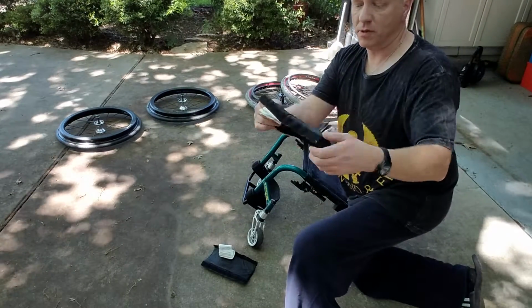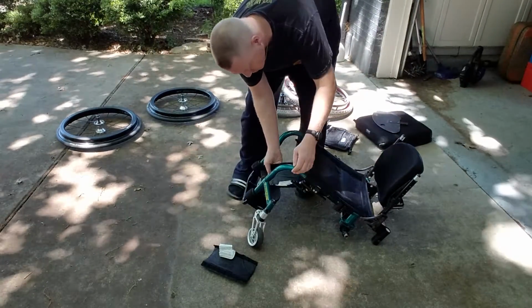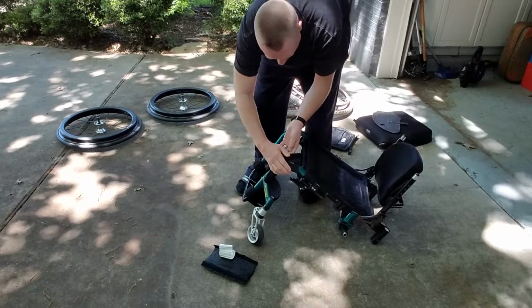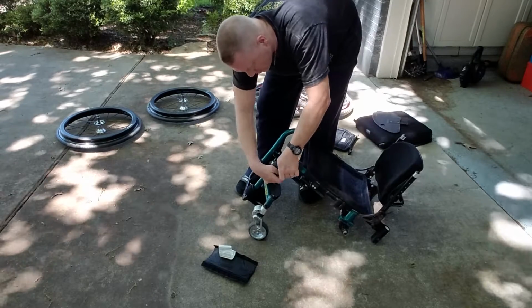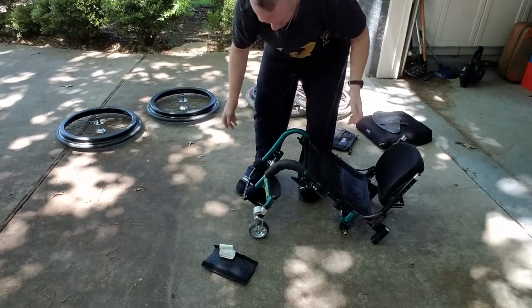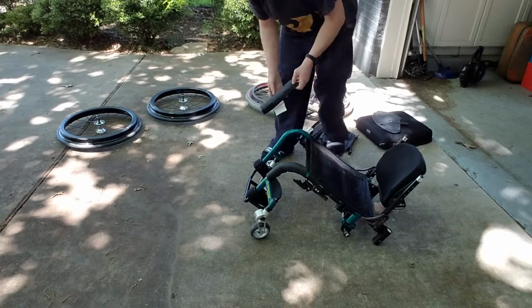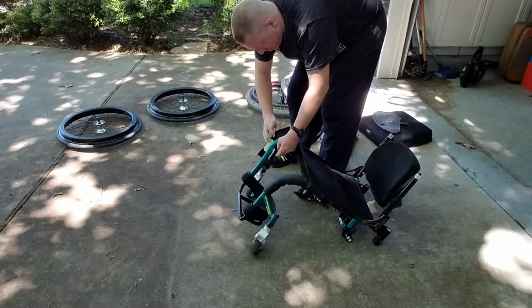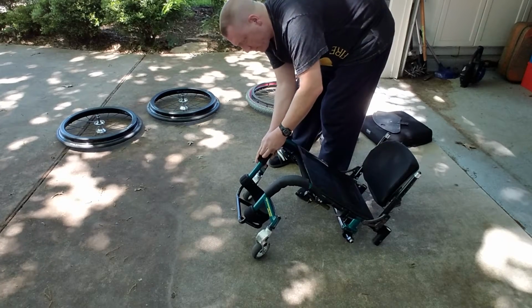It's just Velcro, and it wraps around like this. You take it, wrap it around the frame like that, then come around on the other side, and seal it up. And then once you've got it on there good, you twist it around so the Velcro part is away from where your legs would be. And you do the same thing over here. Just wraps around.